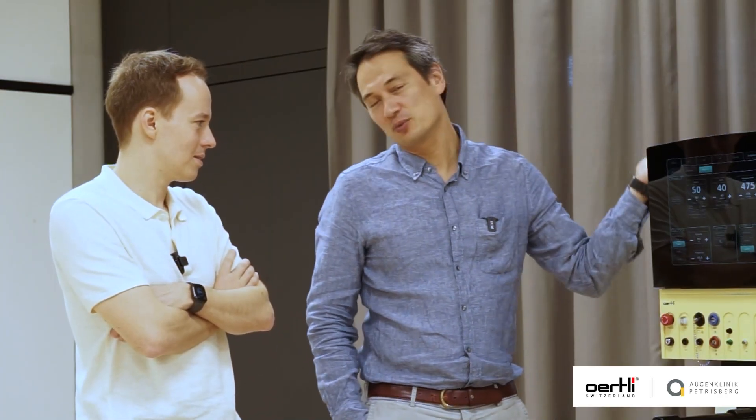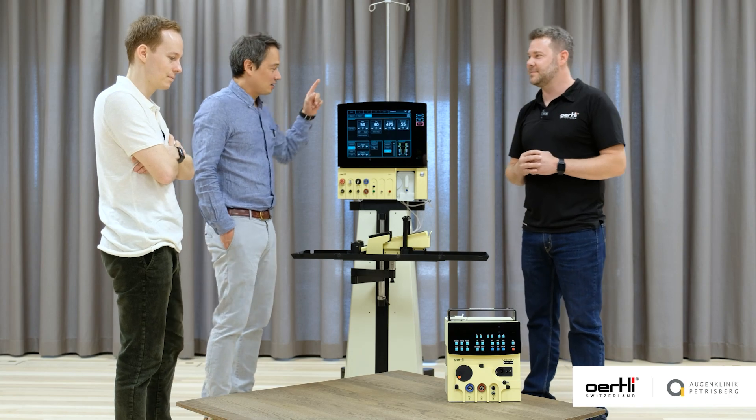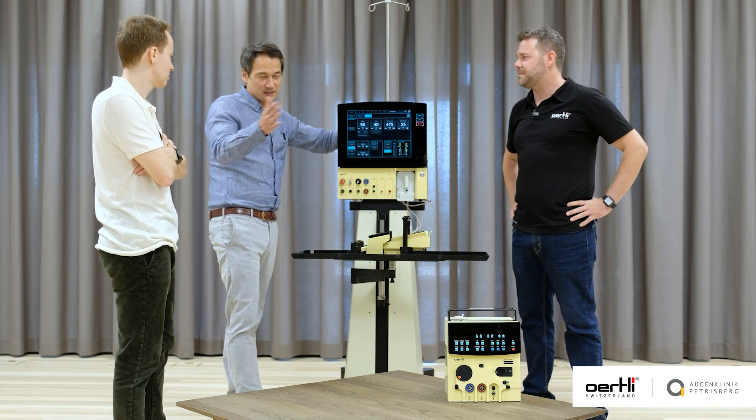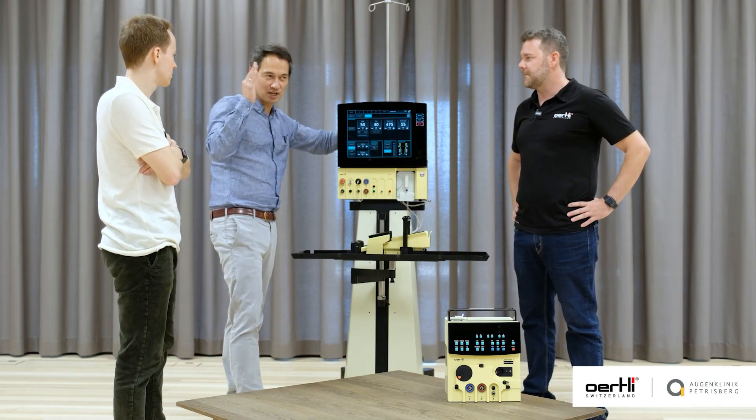There is another thing — we have obviously the OS4 that we like, but there is also what I call the navy seals of phaco machines: that is the CataRhex machine. I started out using the OS4 entirely for the posterior segment, and obviously they need that.